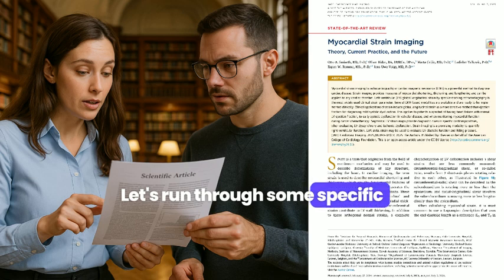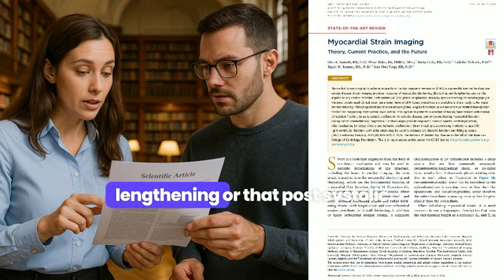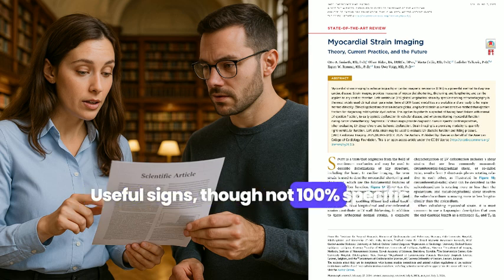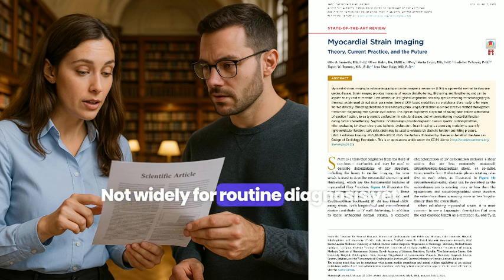Let's run through some specific diseases where strain really shines. Ischemia. In ischemia, you can see reduced shortening, maybe paradoxical lengthening, or that post-systolic shortening we talked about, contracting after the aortic valve closes. Useful signs, though not 100% specific. Is it used routinely for diagnosing CAD? Not widely for routine diagnosis yet.